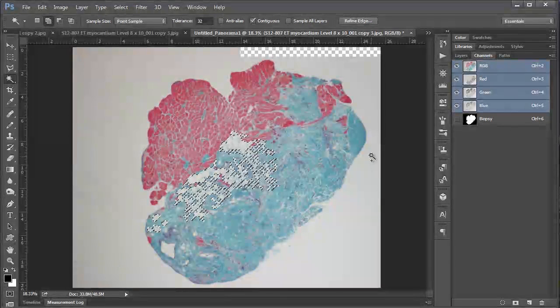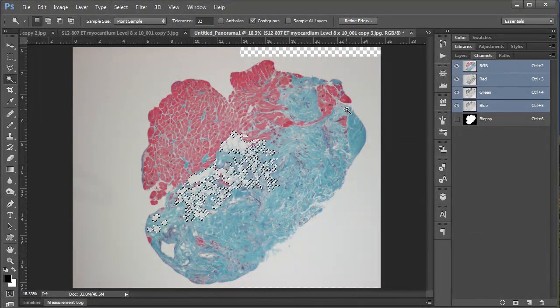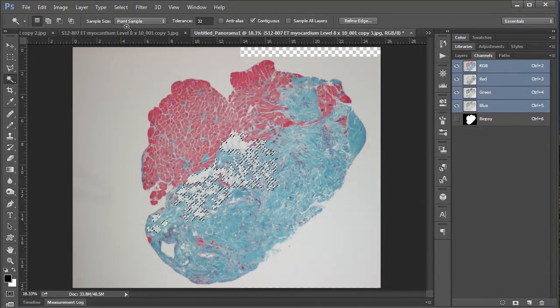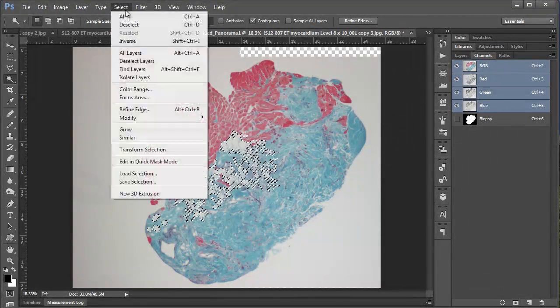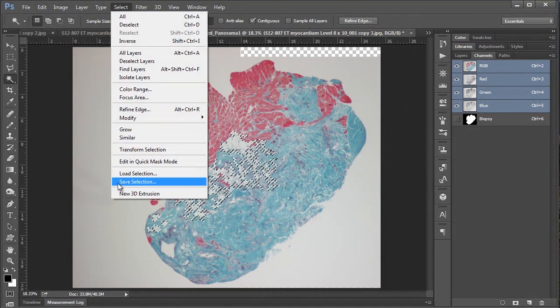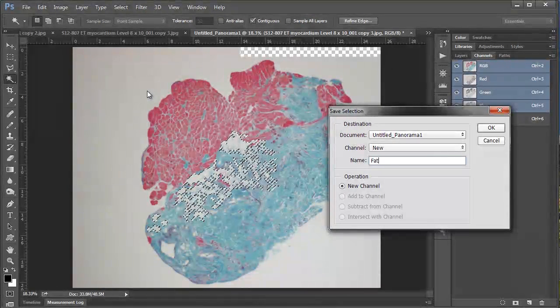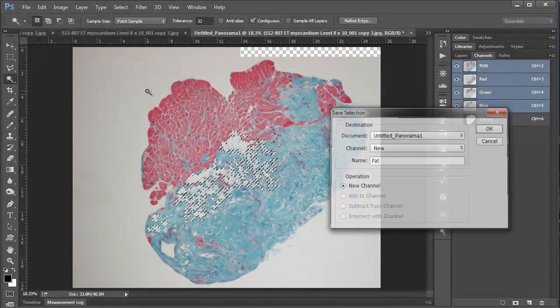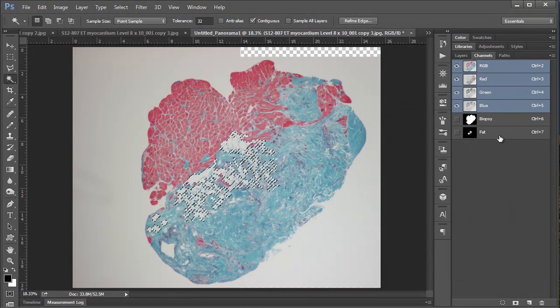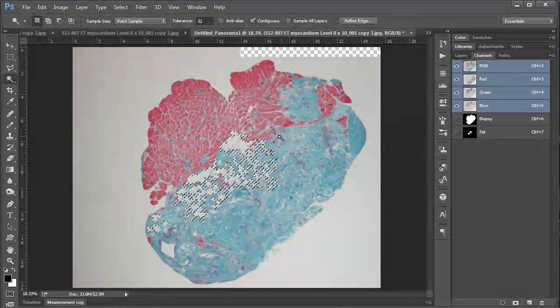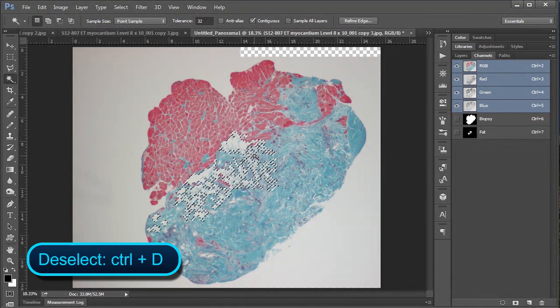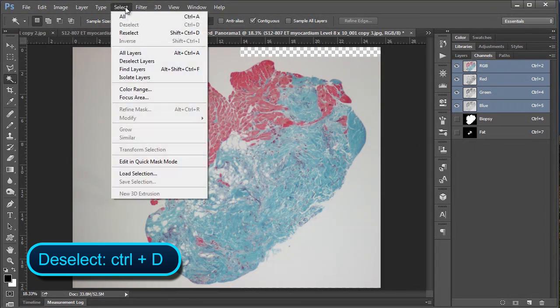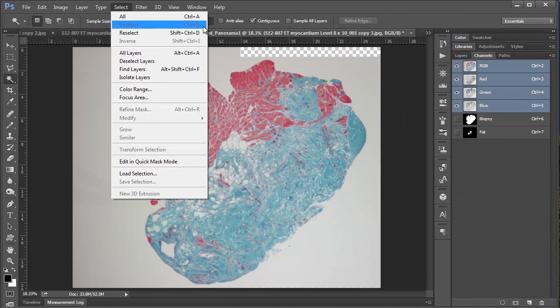But again we're going to do the exact same thing in saving the selection. So we'll go to select save selection. And I'm going to call this one fat and hit enter. And you can see it appear here. And I'm going to deselect now by pushing control D, which you can also do by going select deselect up in the menu.